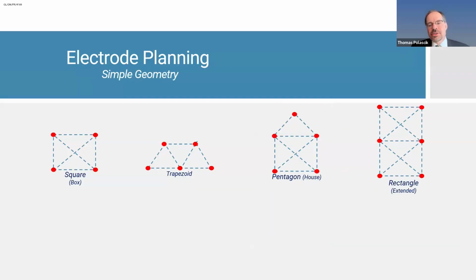So this is where we get into shapes. This is, to me, interesting. I kind of like the box configuration. I showed you a cartoon of putting the tumor in the center of the box. And by the way, as Dr.